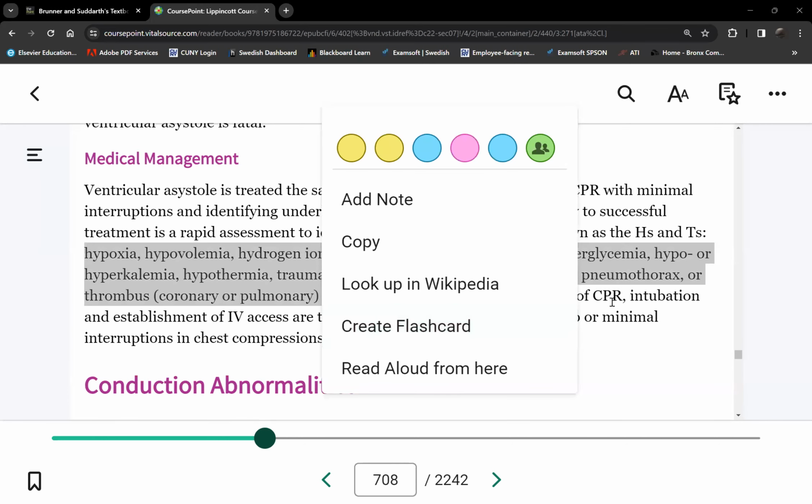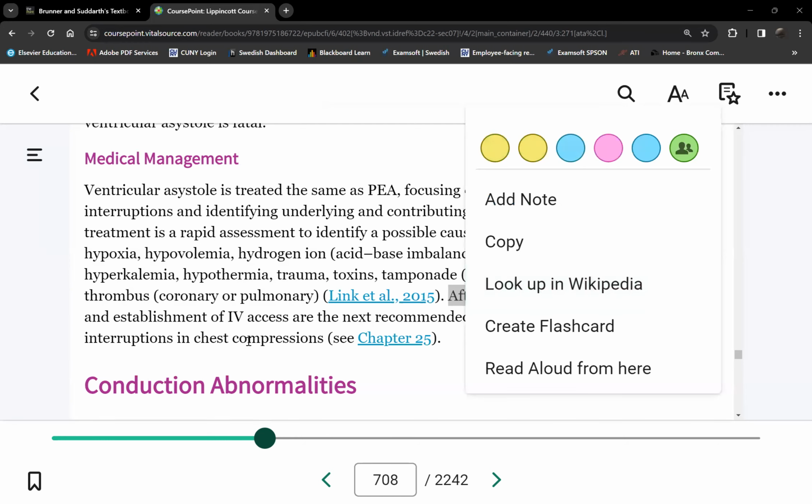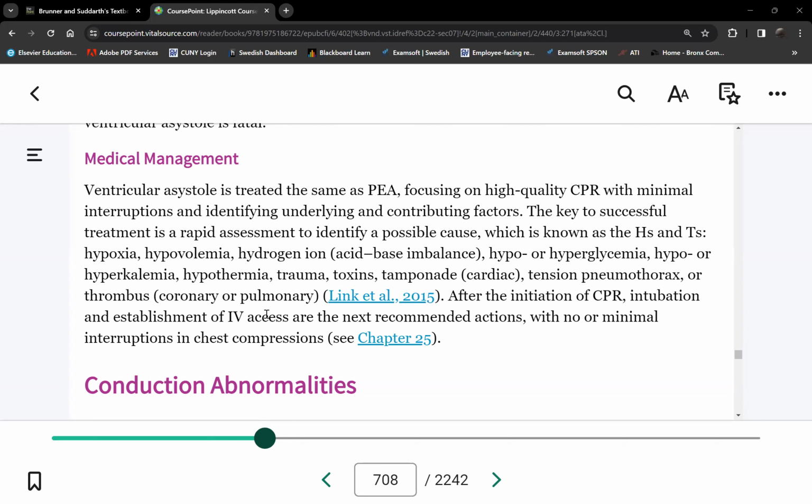Now, the first rhythm, once you start CPR, because it will generate a rhythm. So let's discuss why there is no shock advised in asystole. Because there is no rhythm. Now let's go back. What makes a rhythm? What creates a rhythm? There has to be contractions. Okay, so does that mean there is electrical activity?